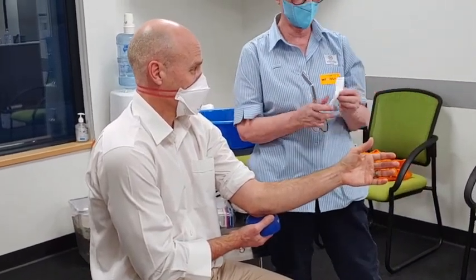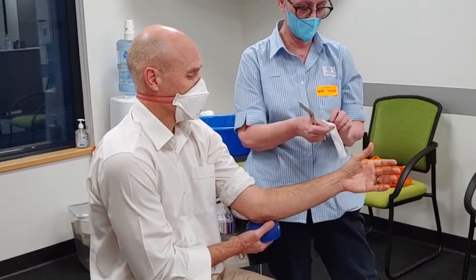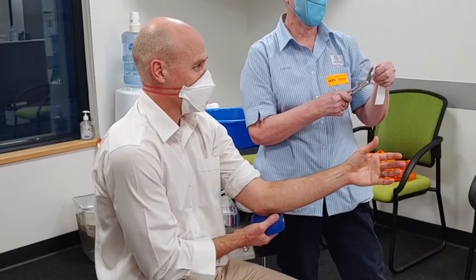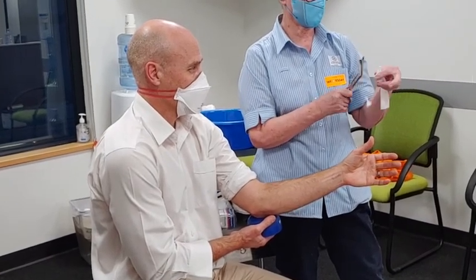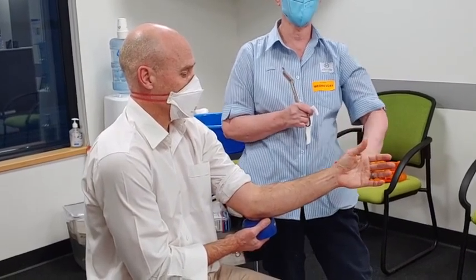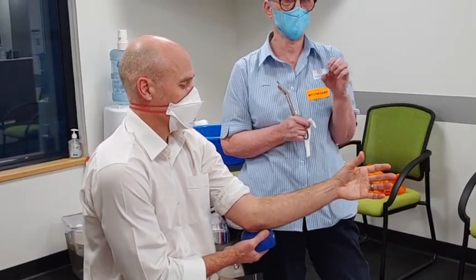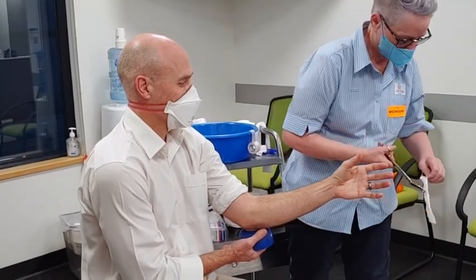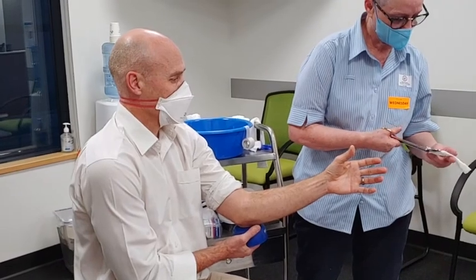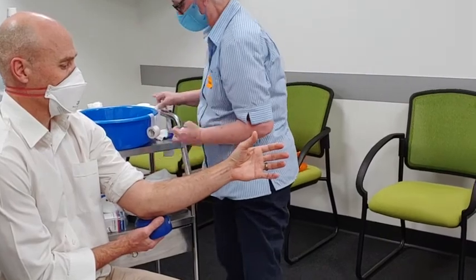We're using a one because we're only going down the thumb to about the big joint. Note I've cut it on a little bit of an angle — the wider part will end up at the base of the thumb, where there's more skin on view. Don't pack too much padding and material in there because the hand will get stuck. Open this out and make a cut down the middle.